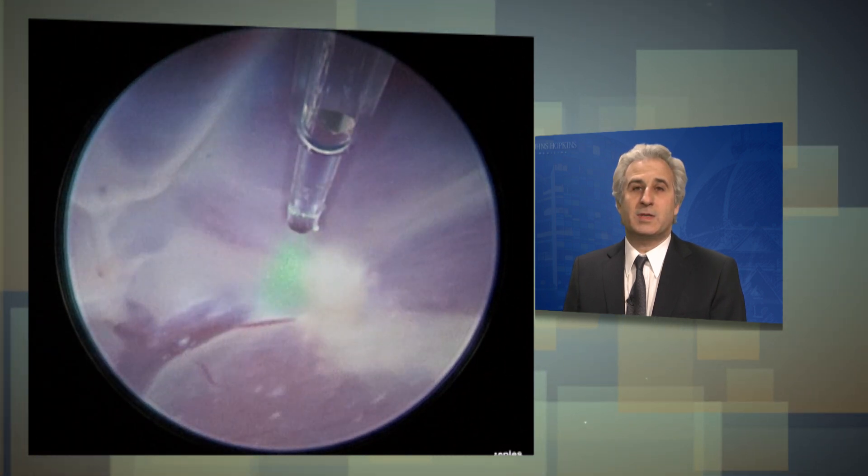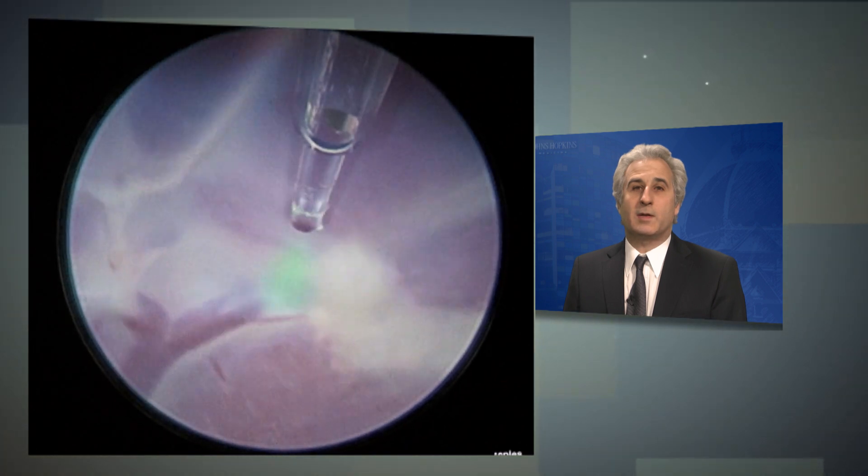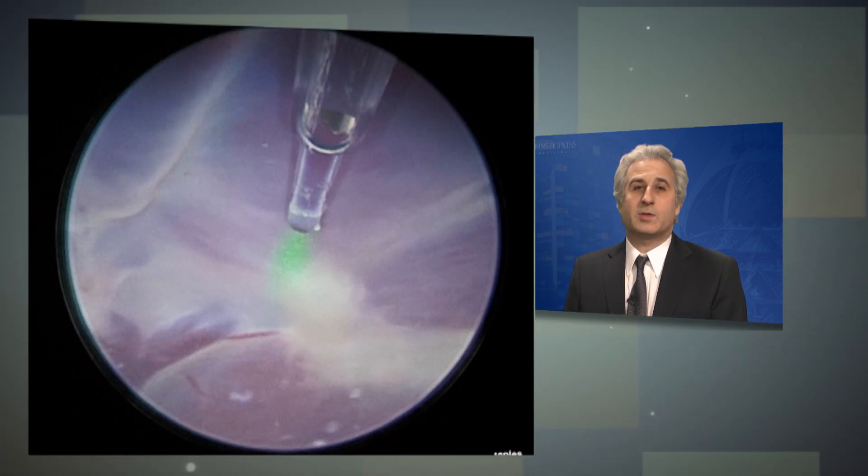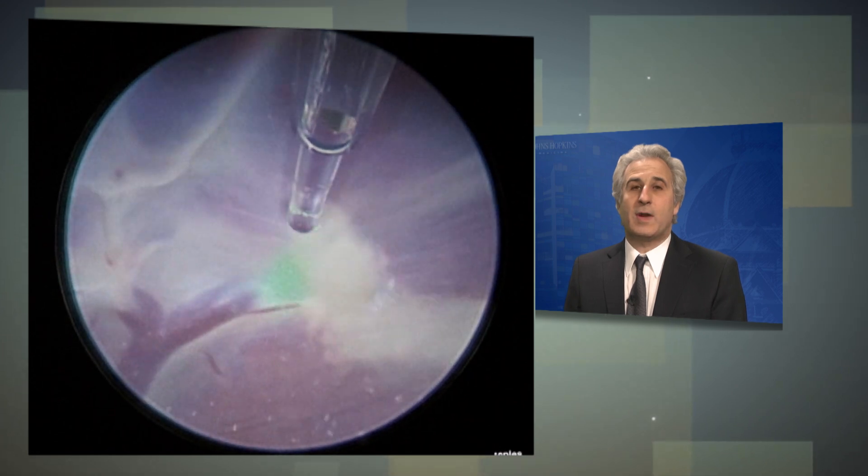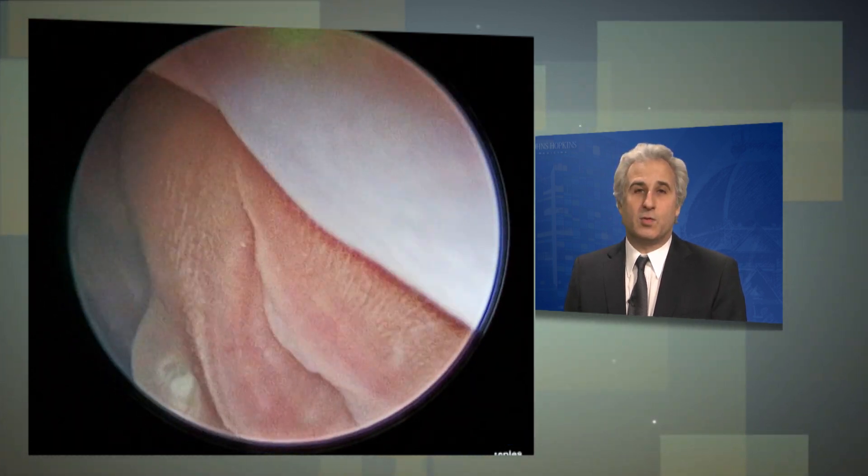And then at the end of the procedure, we will also laser along the line of the vascular equator, which is the natural dividing line between the two twins, and then drain the fluid in the sac of the recipient so that it is normal.